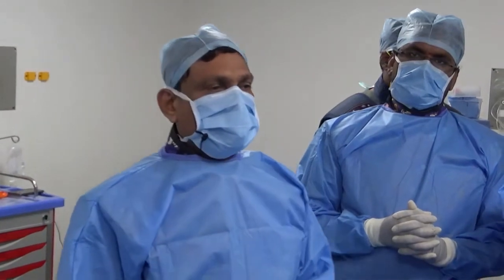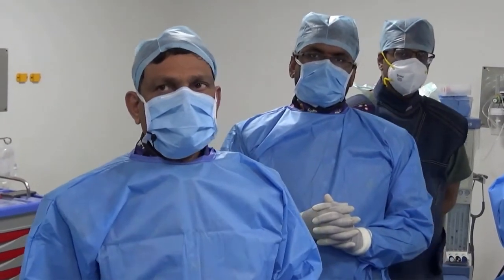The device, the... Can I make an exit point. Sorry, please go ahead, Bharat. Can I make a comment?